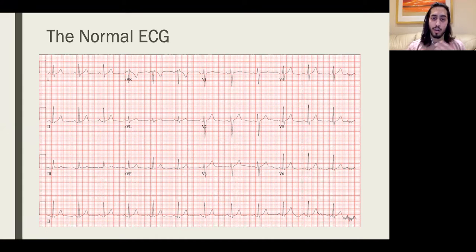It is calibrated to the appropriate standard, starting with the rate, a rate of approximately 70 beats per minute, with a normal sinus rhythm and a normal axis with no axis deviation present. Going through the ECG systematically, P waves are present with normal morphology throughout the ECG. PR segment and PR interval is not lengthened and is consistent throughout the ECG.